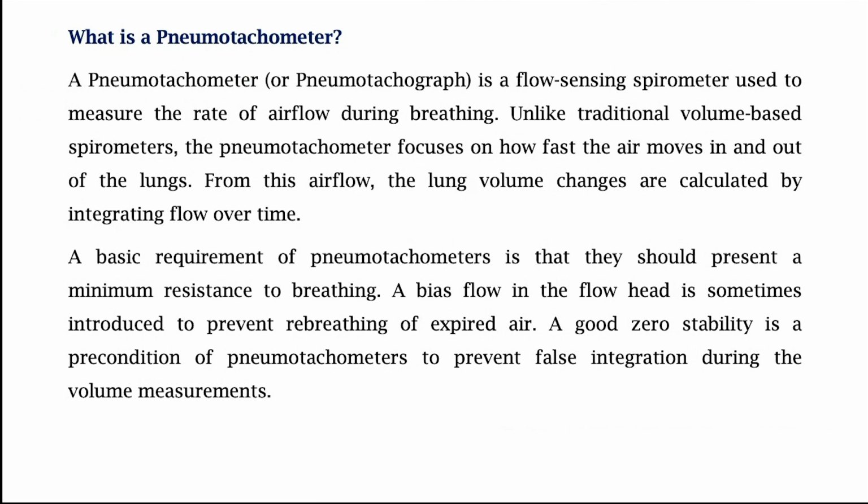Think about it similar to water flowing through a pipe. Essentially, in your home, you are having a water flow meter. If water is flowing through a pipe, and let's say this is a flexible pipe, and it is being constricted, if there was no pressure difference between the two ends of the pipe, then there will be no flow. Suppose I'm constricting that flexible pipe, and I'm just trying to step on it with my shoe. Then what will happen?